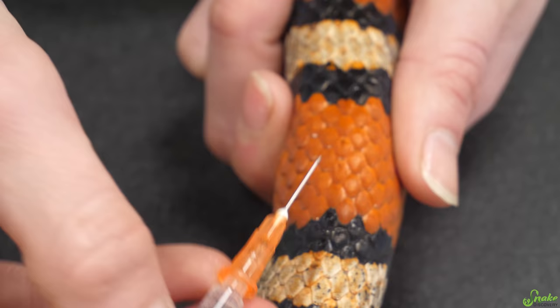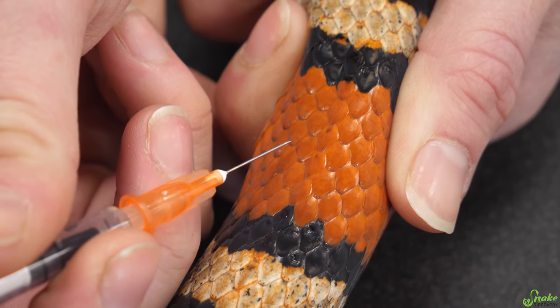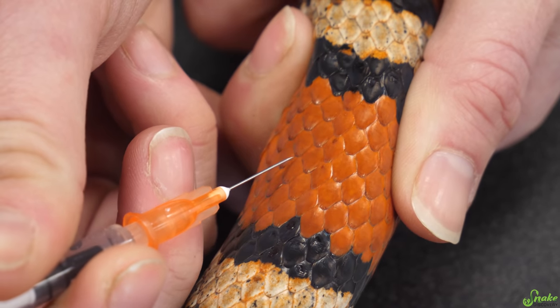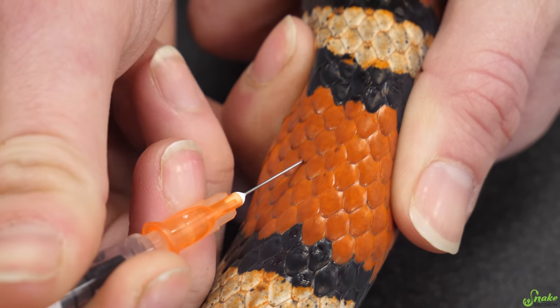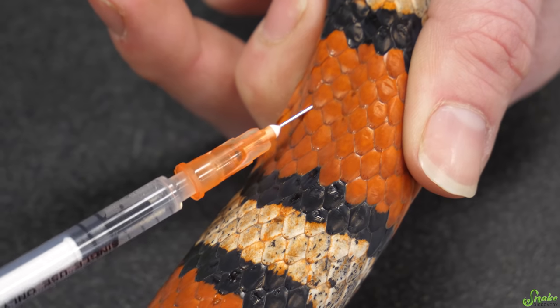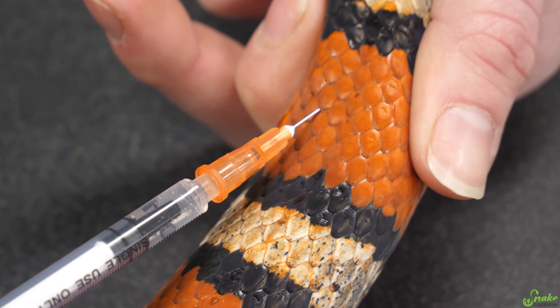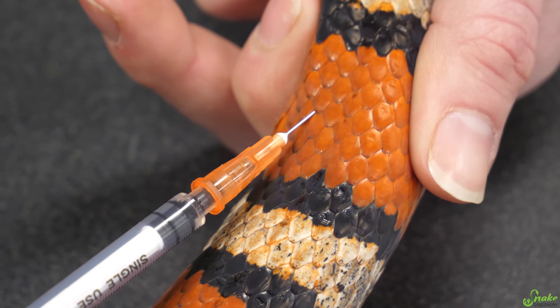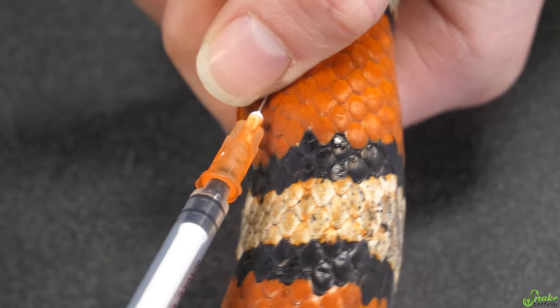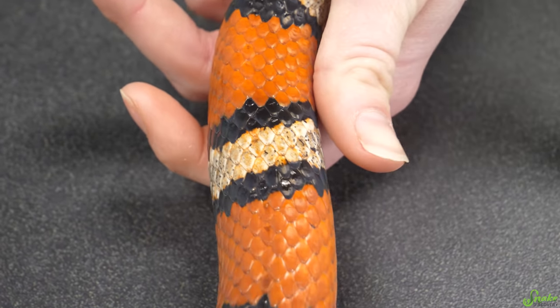So for Tutti Frutti, we're going to put our injection not on the spine itself — you don't want to push a needle up against a bone. We want to go into the muscle tissue just beside it. We're going to insert our needle with the bevel facing out, get it into the middle of that muscle. The needle should go in at about a 45 degree angle. We're going to pull back slightly on the plunger to make sure we didn't hit a vein — which we didn't — and then slowly push the medication in. Put our thumb over the needle as we pull it out, and apply pressure for a couple seconds. And voila, we're done.